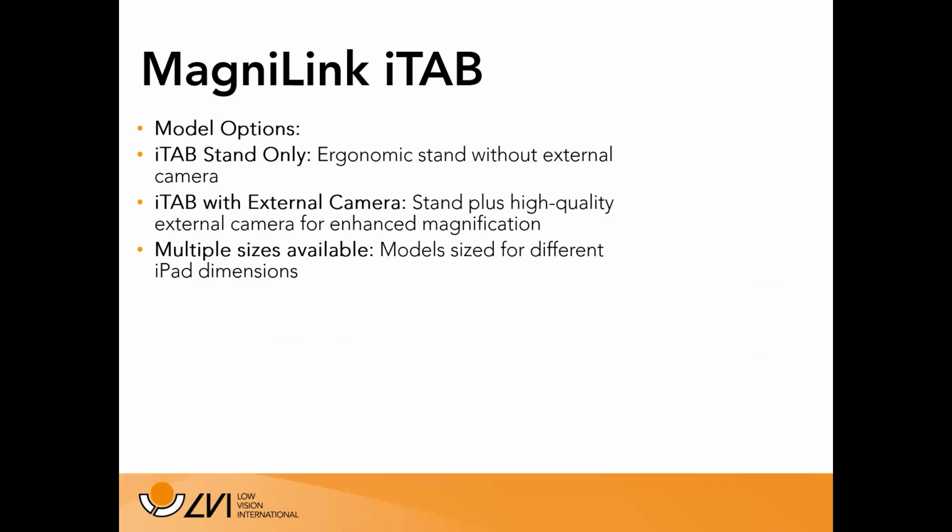The second option would be that iTab stand only without the external camera. And in that instance, you may want to use the device, the iTab stand, with another one of our cameras. And we'll talk about some reasons why that might be a logical solution in just a minute.